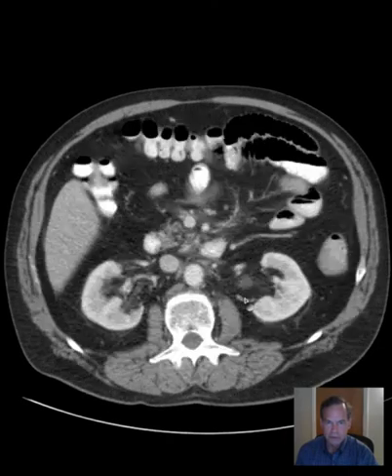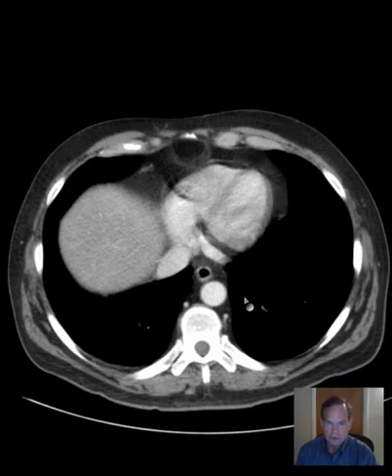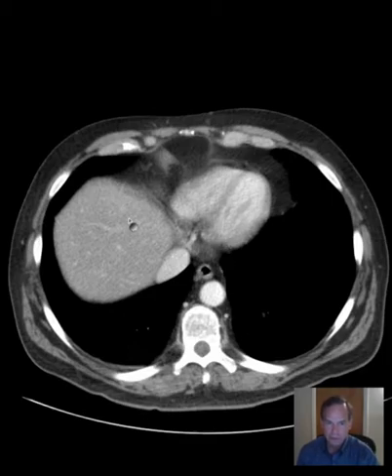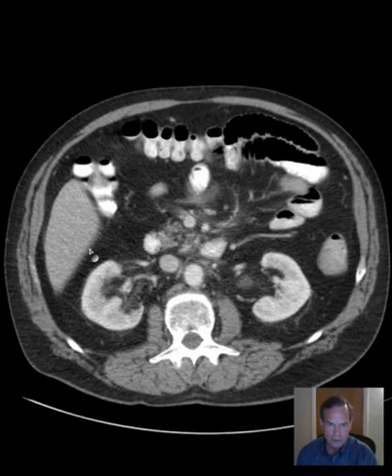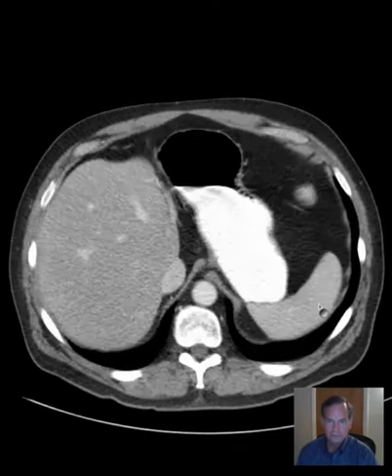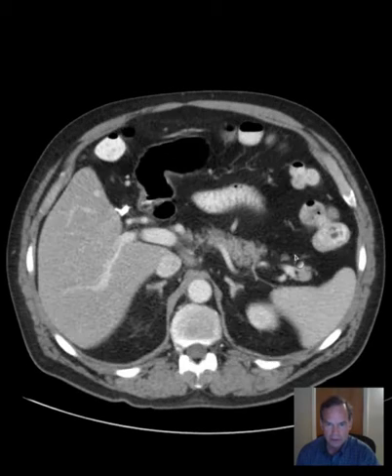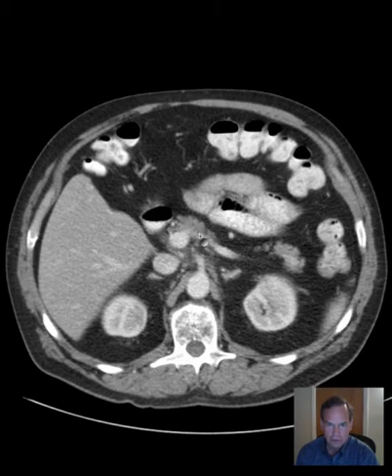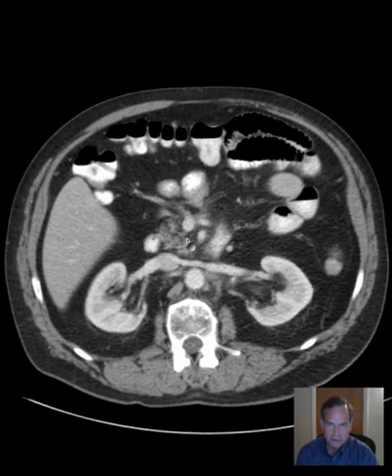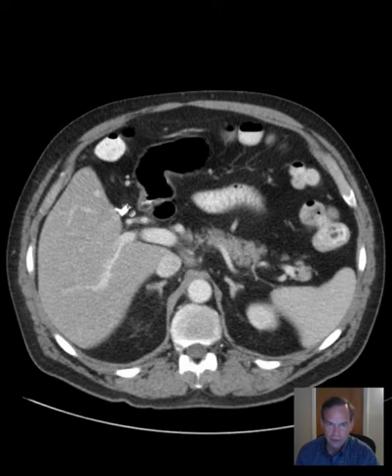But before we get into the abnormalities, I want to go through our standard list of items to check, and that includes the liver, spleen, and pancreas. So I look at the liver, then I scroll through the spleen, and the pancreas. Here's the pancreas here. It curves around like that in the head. Here's the uncinate process. Liver, spleen, and pancreas appear okay.